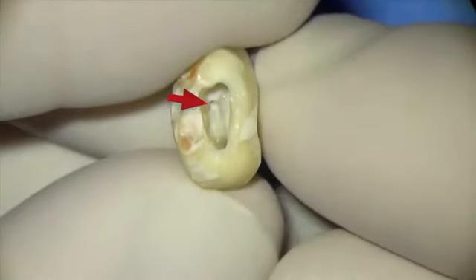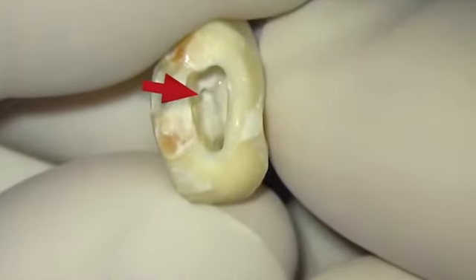Two-dimensionally on the radiograph, we obviously can see one curve, but you and I know there's actually two curves to this patient's distal buccal canal. The distal buccal canal has a dentinal triangle, which absolutely needs to be removed in order to have straight line access.